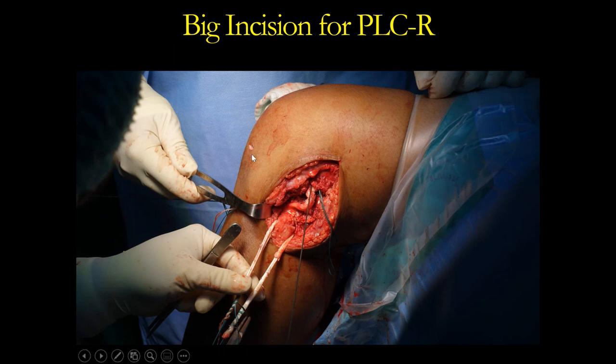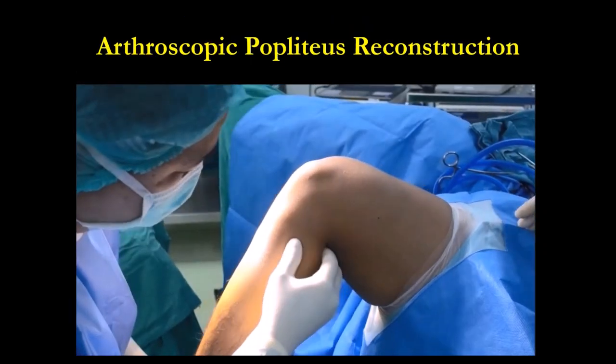I don't like this — this is a big incision and you cannot see very well. Even in open surgery, sometimes you cannot see the tibial tunnel. You need to use your finger to protect it, and many times it's not anatomic. Because you need to go in the line of the Popliteus — you go blind; you're not at the musculotendinous junction. The musculotendinous junction of Popliteus you can see from the arthroscope.